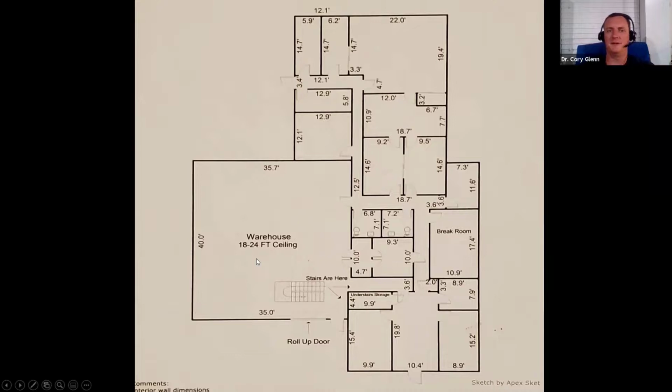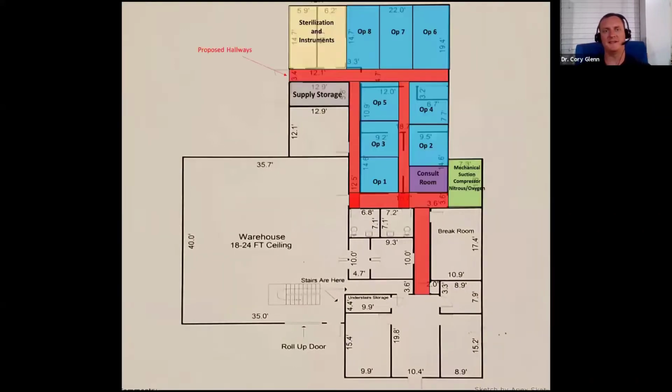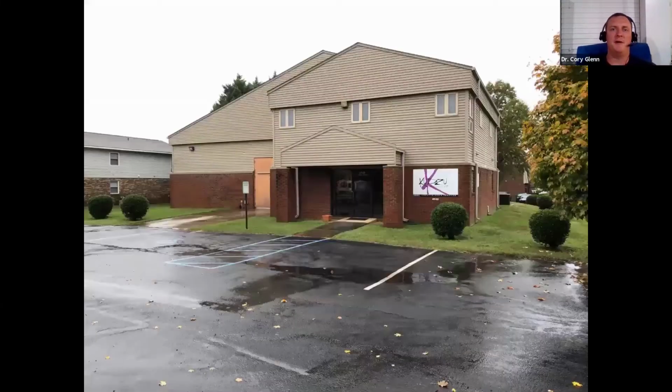So again, you're going to be hearing lecturing about, let's say, milling or printing, and that mill or that printer is right there next to you and you can see it in action, use it, all that kind of stuff. So those are just some of the proposals we've played around with.